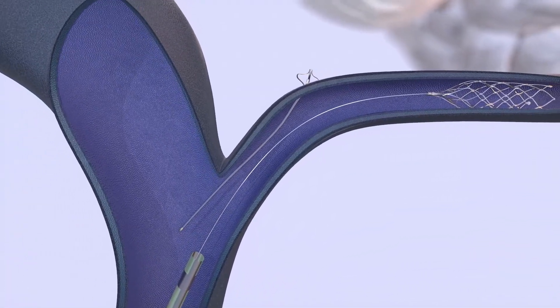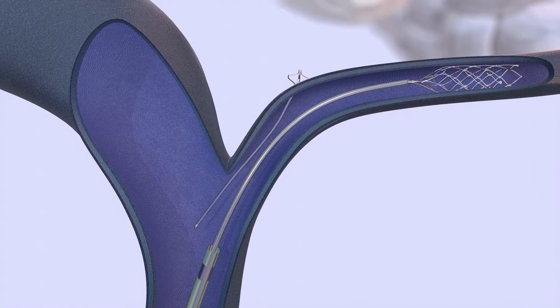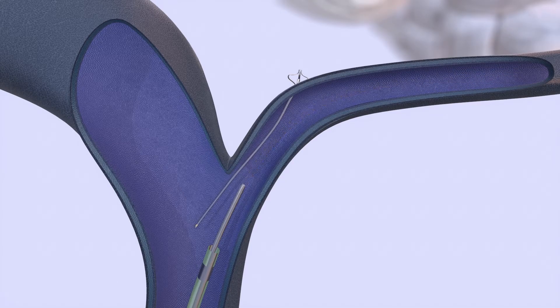Once the implant is in place, the micro catheter is reinserted over the flat rail and advanced into the IPS beyond the deployed implant. The anchor is recaptured into the micro catheter and removed from the patient to complete the procedure.